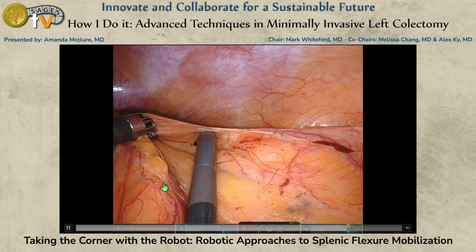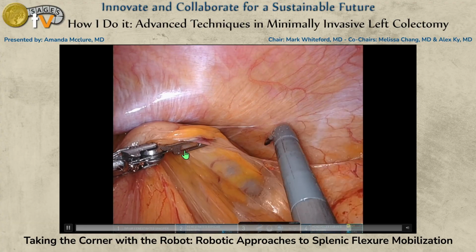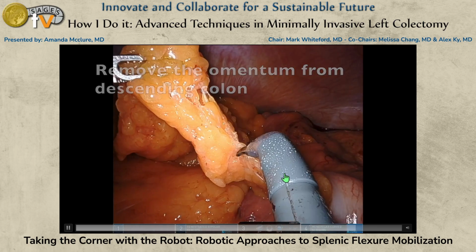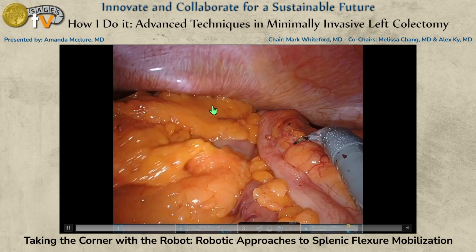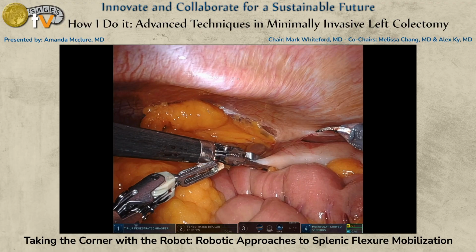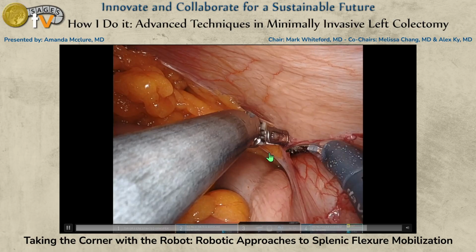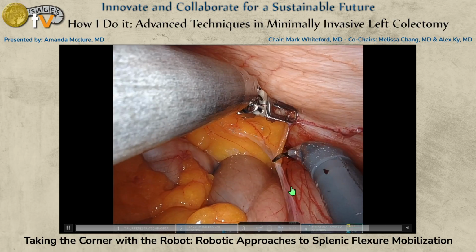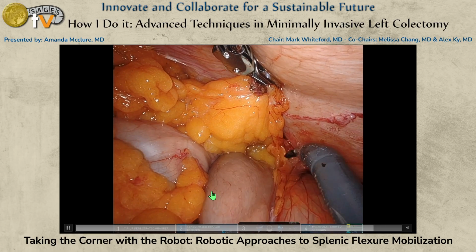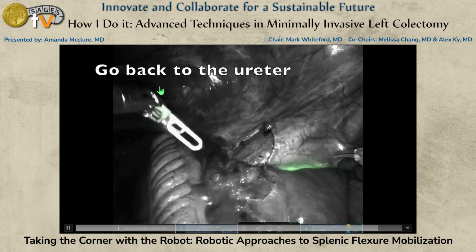Again, you're seeing that I'm walking up here, so we're keeping that assist arm either in front of or underneath, and then bringing the colon up and out of the body. You always have to take the piece of omentum that's stuck to the descending colon off, and then you want to pull down with your arm here. You're going to come up and over into flexure, so you create your own space with that bipolar. You're creating your own space and being able to get through flexure, and then you just continue pulling your arm down and away so that you're not creating tension and collisions.